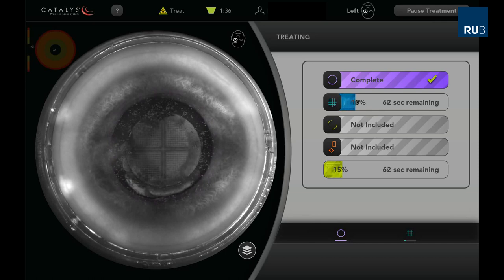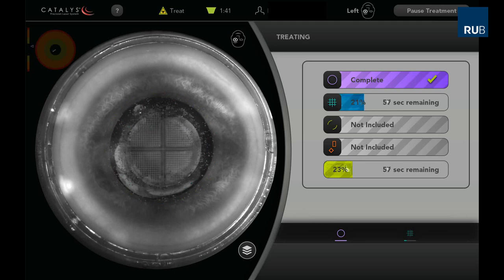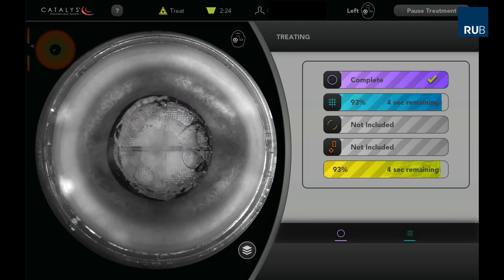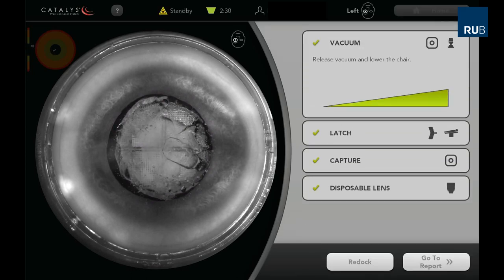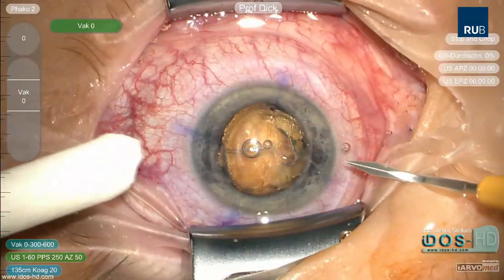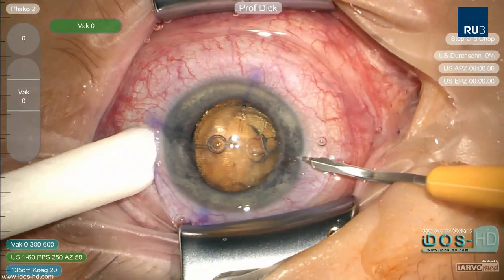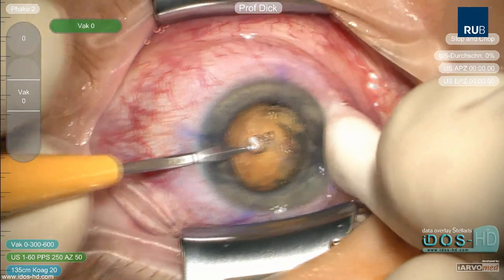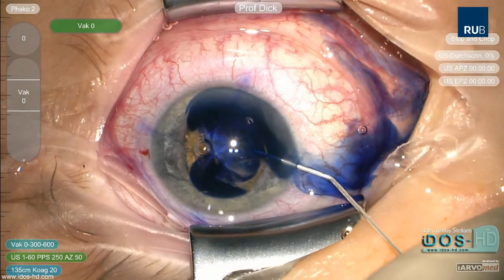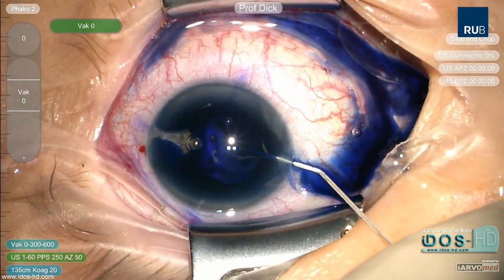The central lines are cut three times. After undocking, two 1.2mm paracenteses are made. Vision Blue is used to stain the anterior capsule and the anterior chamber is filled with OVD.